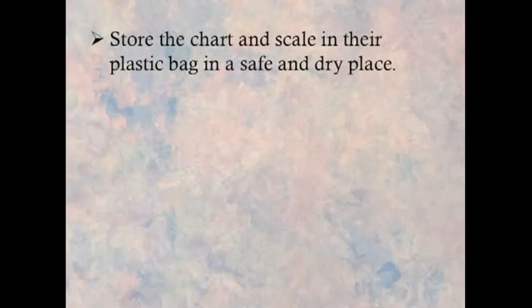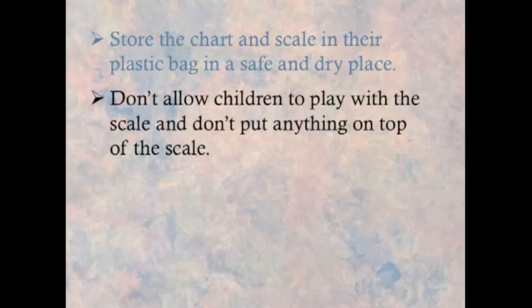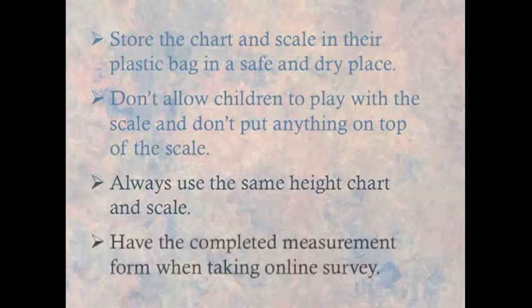When you finish taking your child's measurements, remember these important points. Seal the height chart and the scale in the same plastic bag they came in. Then store them in a safe and dry place. Do not let your children play with the scale, and do not set anything on top of it. Each time we ask you to take your child's measurements, use the same height chart and scale. Finally, have the completed measurement form with you when you take the online survey.